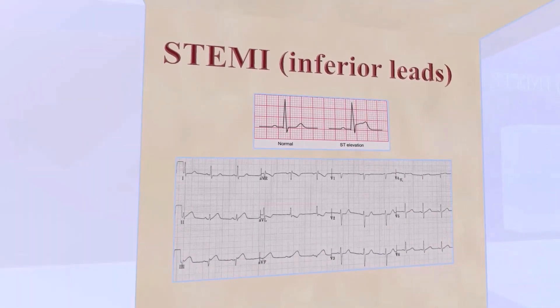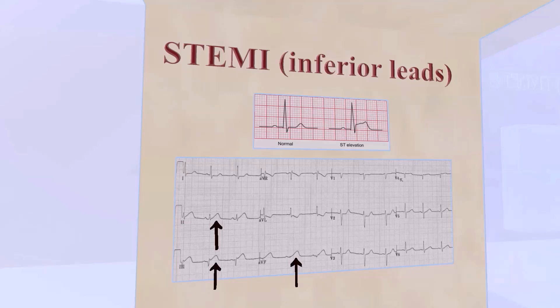Welcome to the STEMI room. STEMI stands for ST segment elevation myocardial infarction. In a STEMI, the ST segment is elevated compared to normal rhythm. In this example, we see ST segment elevation in leads 2, 3, and AVF — because these leads point toward the inferior myocardium, we know this is an inferior myocardial infarction, probably caused by a right coronary artery occlusion.